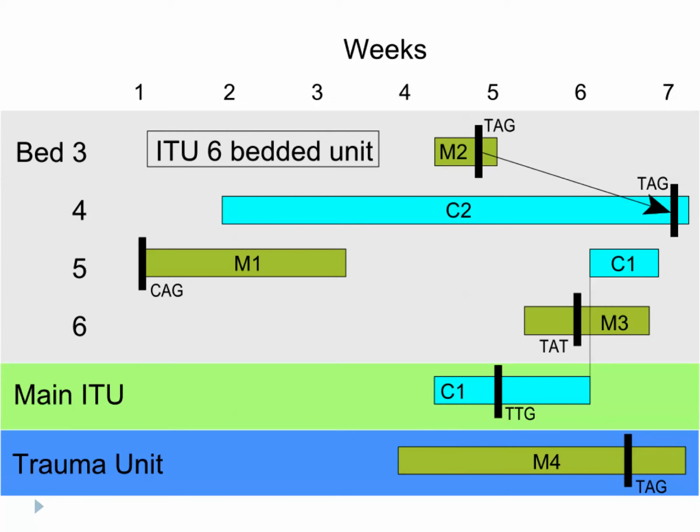It's a bit early in the morning, but some of you might have noticed that, hang on, this patient down here has got the same genotype. Well, we looked at what happened in the hospital, and it's clear that there had been no contact between that patient and the other 2. But those 2 military patients, M2 and M4, it turns out, had been repatriated from Afghanistan through the same care pathway. And our assumption is that they both got infected with this particular strain before they came into the hospital, somewhere in a field hospital or somewhere along the route. So it does make sense.